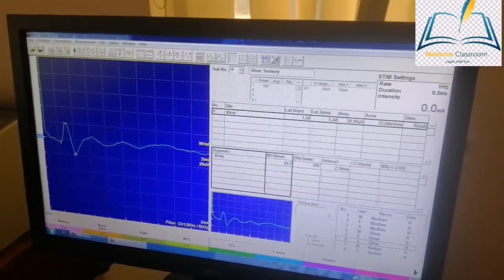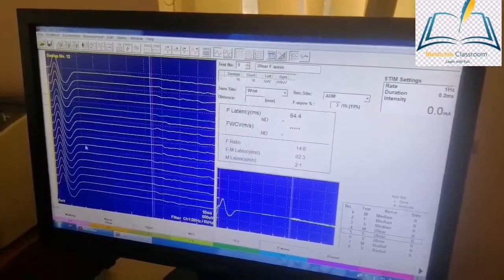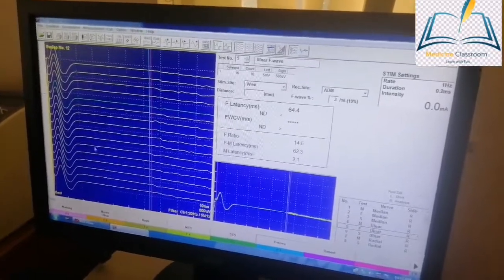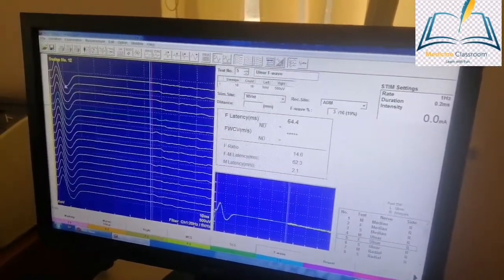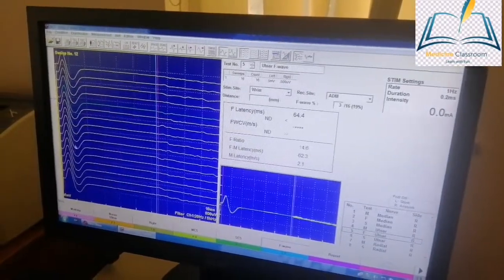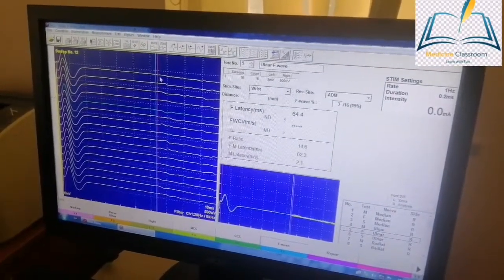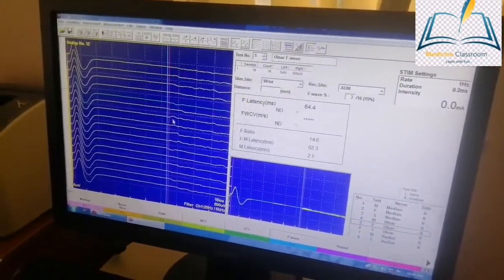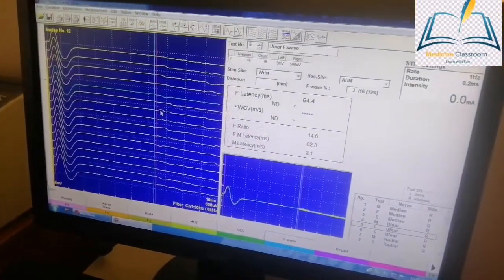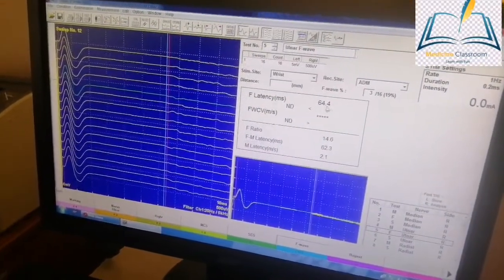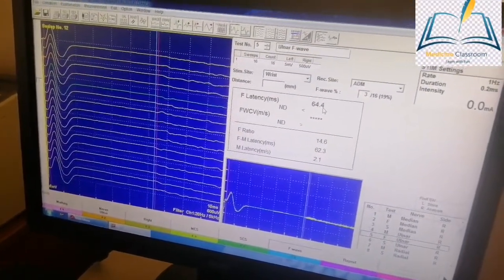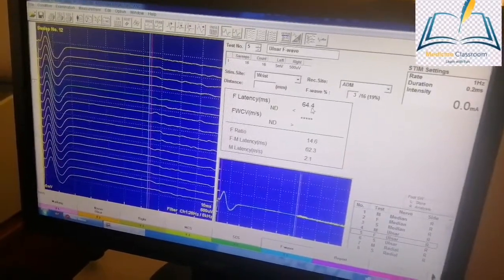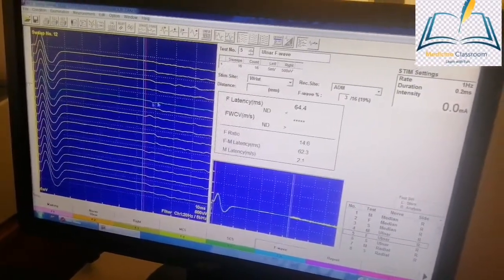Let us look for the F wave. We know the F wave checks for the proximal segment, usually the roots. On giving repeated suprathreshold maximal stimulus, we have to see the F waves. In most of the stimulus we can see any F wave. Here in this slide you can see the F wave, but the F wave is 64.4. Usually in the upper limb we take up to 30. If it is less than 30 it's normal, but if it is more than 30 it's abnormal.